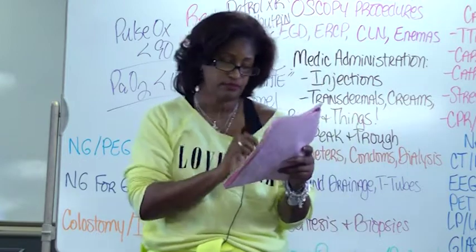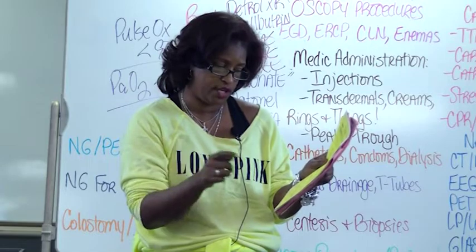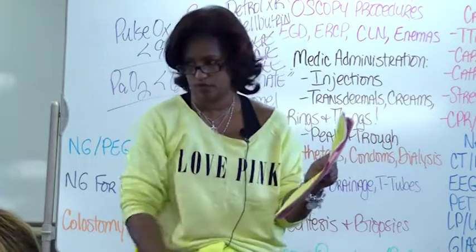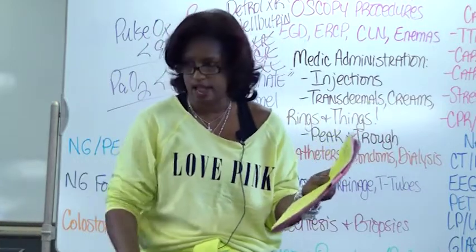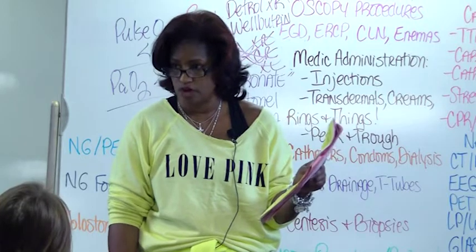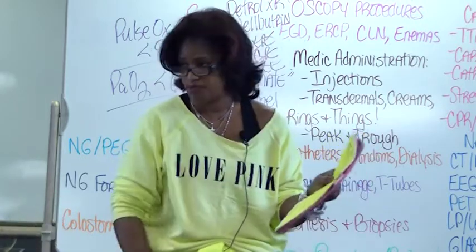Okay? Now, look what it says next. And yes, you do care that it says it next. It has a big, huge next: check for gastric residual. If you ask all the nurses in this room, because y'all going to see it, because y'all in here and they not, how do you prevent aspiration? You know what they're going to tell you? Check the residual. No, you don't. You check that pH. That's how you prevent aspiration.